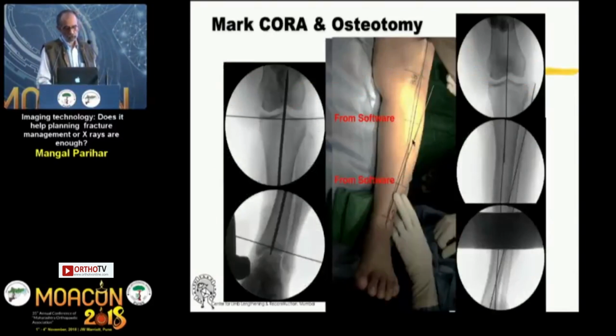So all of these markings, the distance of the osteotomy from the knee, this is all obtained from the software. And there's very little thinking that needs to be done in the theater. Most of the thinking and planning that has to be done is done outside theater.